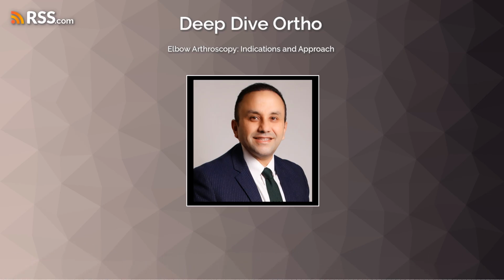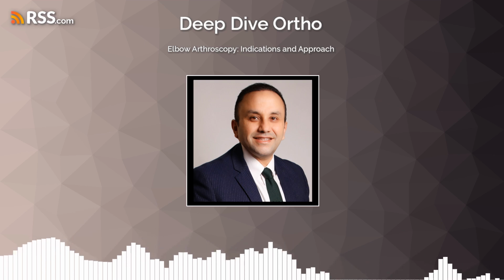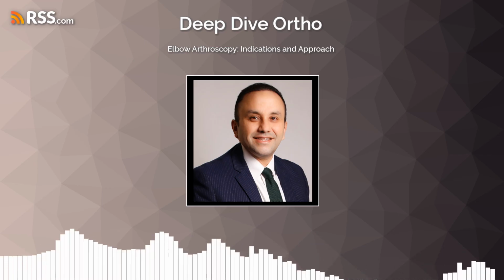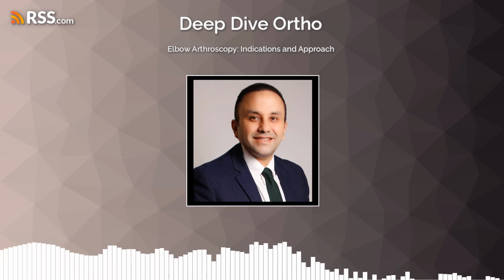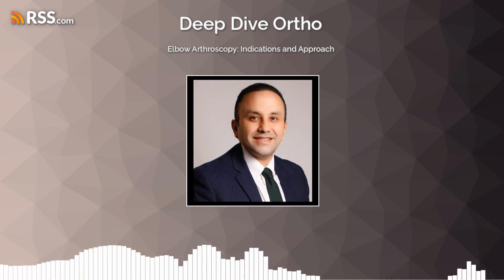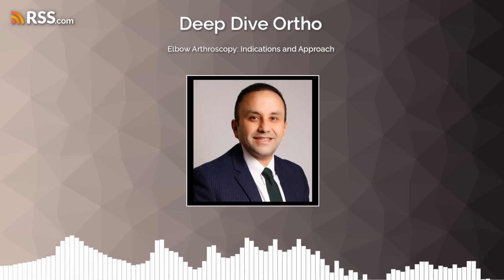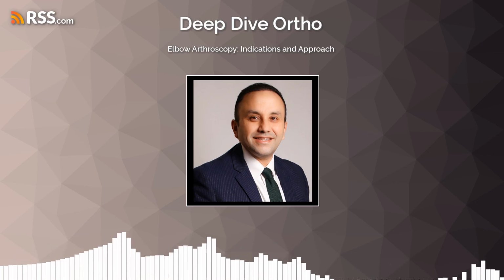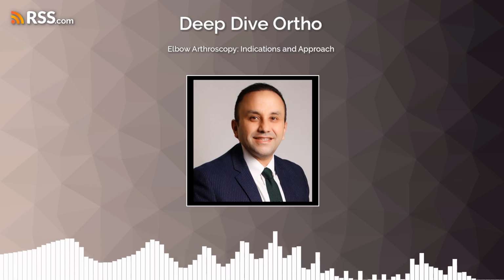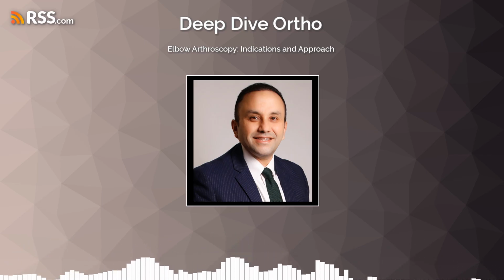Precisely. Finally, for condylar fractures of the distal humerus, the fracture line can be manipulated with a shaver tip or a freer elevator. A large bone reduction clamp can be placed on the medial and lateral epicondyles to reduce and compress the fracture. Direct visualization from the anterior compartment helps minimize articular cartilage step-off. Guide pins are placed under fluoroscopic guidance, and cannulated screws provide definitive fixation, crucially keeping the reduction clamp in place during drilling and screw placement to prevent any loss of reduction. A combined approach using imaging and direct vision.